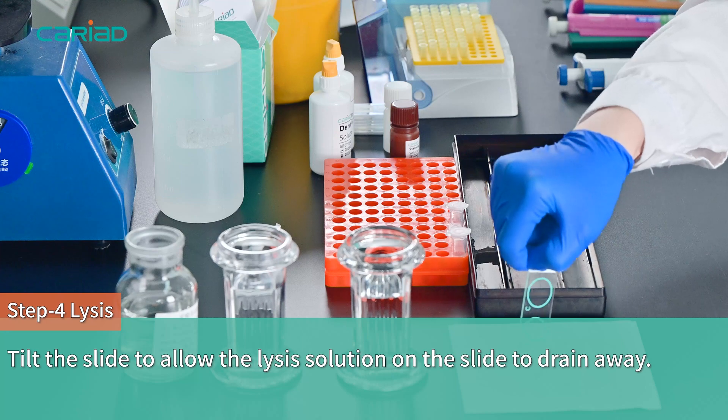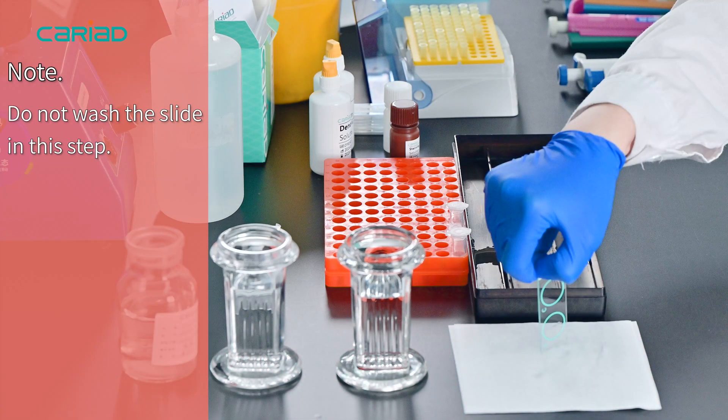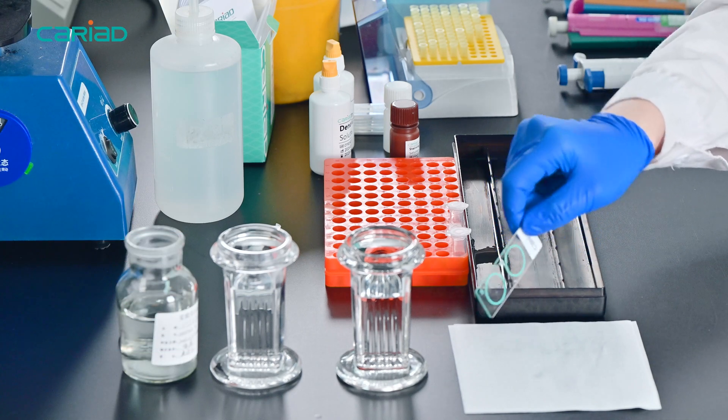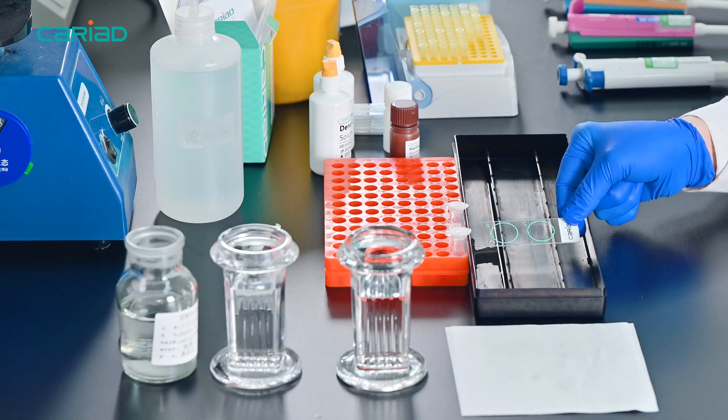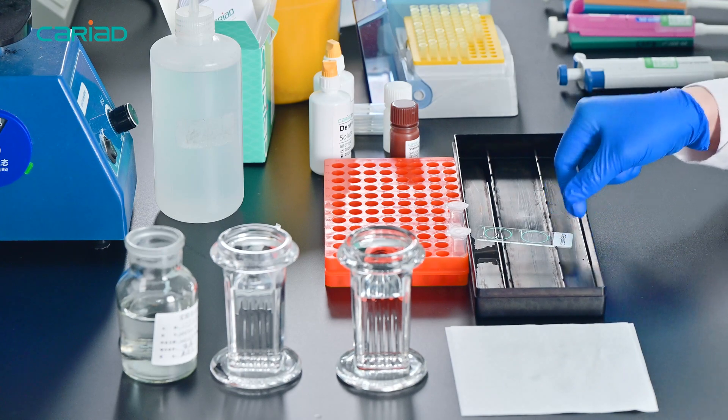Note: do not wash the slide in this step.